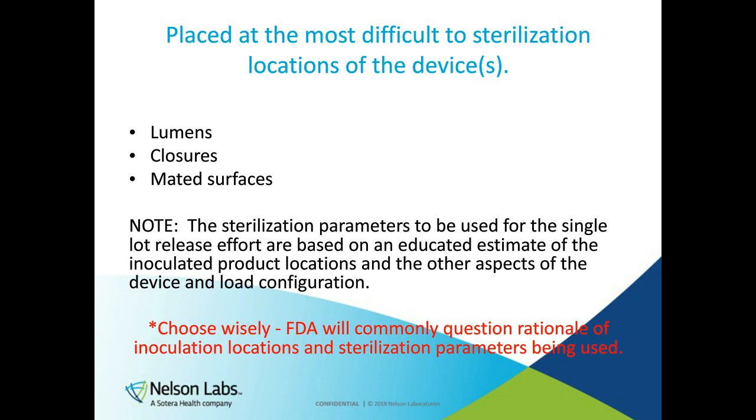And when choosing the inoculation locations, like I said, you need to choose wisely, as the FDA will commonly look and question the rationale of choosing those locations for the single lot release process.